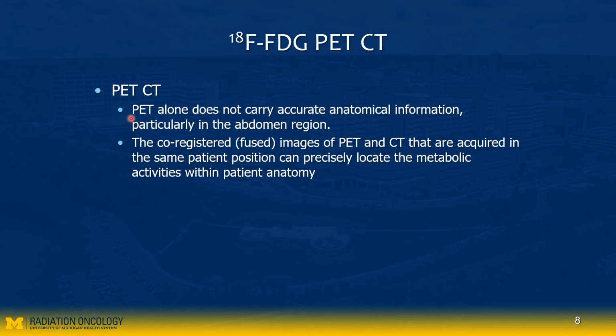As I mentioned briefly, PET imaging itself does not have very high resolution. It doesn't have accurate anatomical information. There's a reason why PET image resolution is inherently that poor. I'll explain it in the next slides.